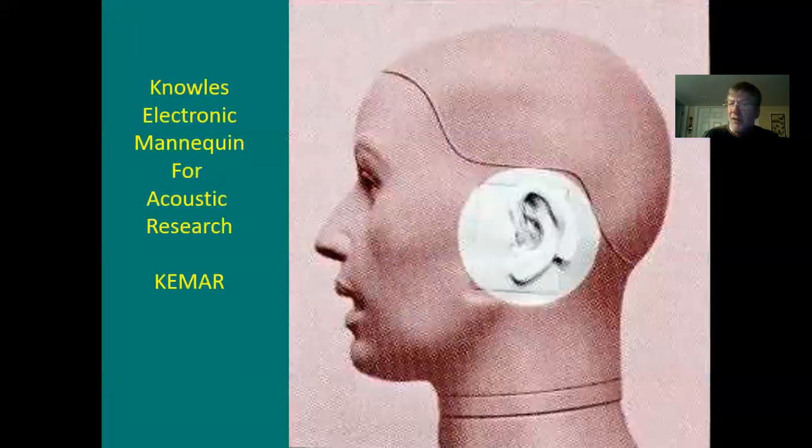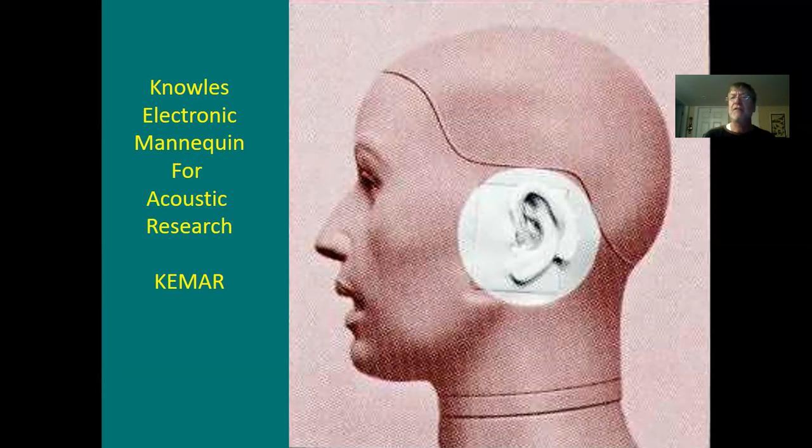There's another picture of an ITE. Okay, same thing. Here's KEMAR, Knowles Electronic Mannequin for Acoustic Research. All manufacturers have a KEMAR. It's got rubber ears, and guess what?